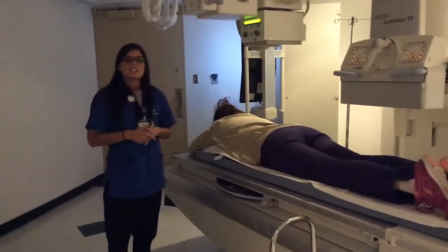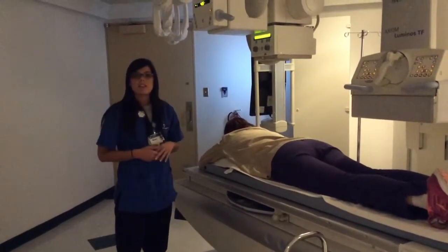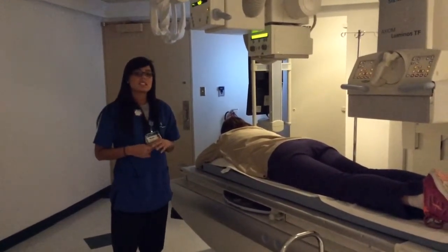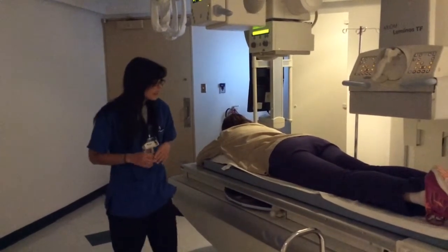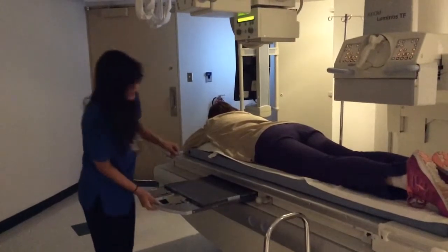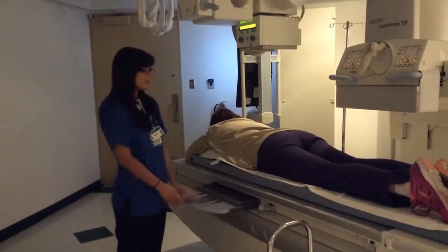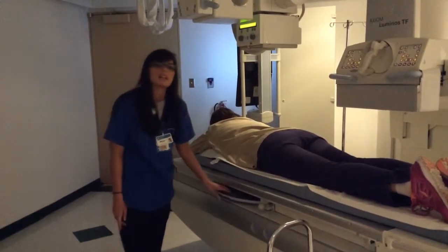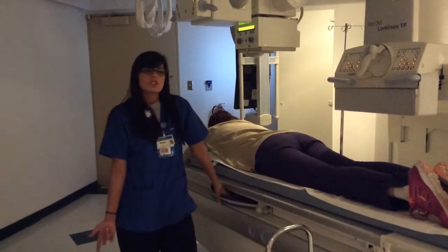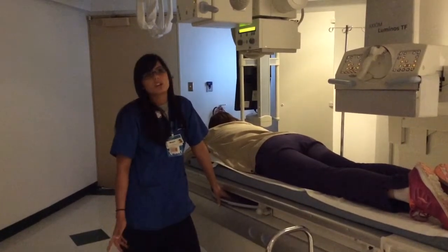My name is Megan Voss, and today I'm going to be demonstrating the procedure that best demonstrates Crohn's disease. Typically, it would be a small bowel series, which is a barium contrast exam. The patient would be instructed to be NPO for 8 hours prior to the exam. This is due to the fact that food can mimic a pathology or cover it up.